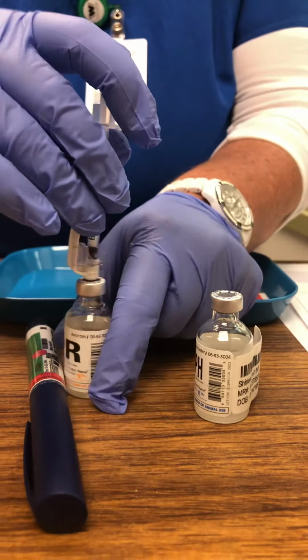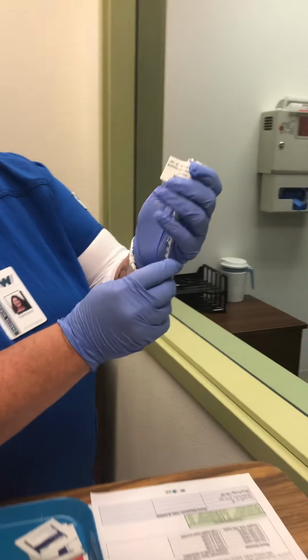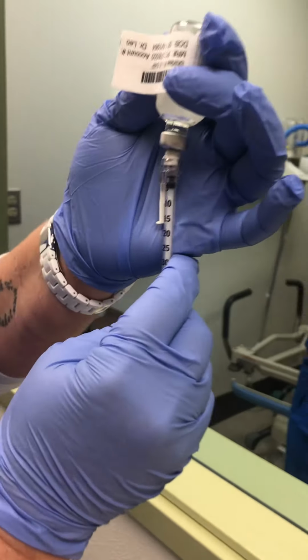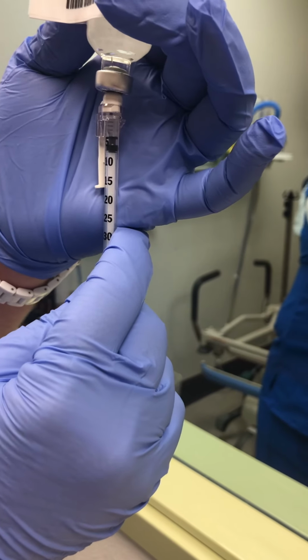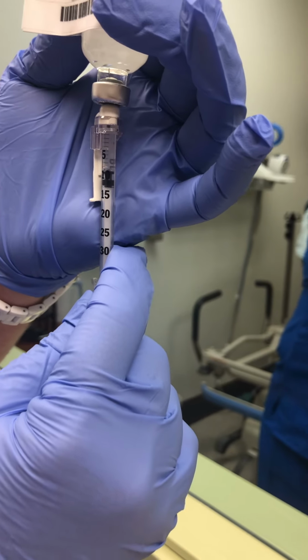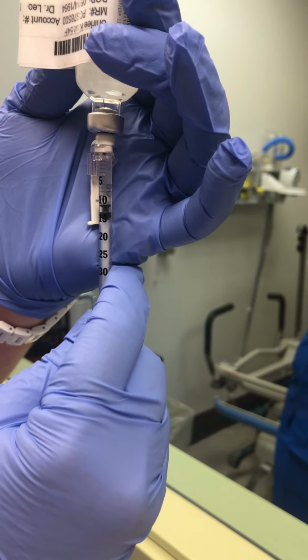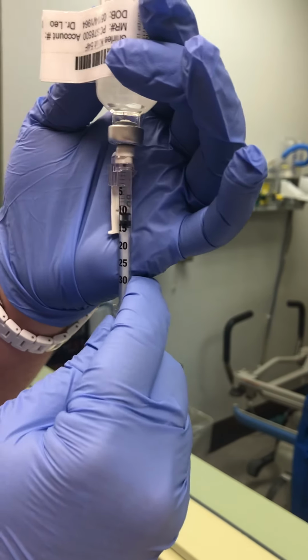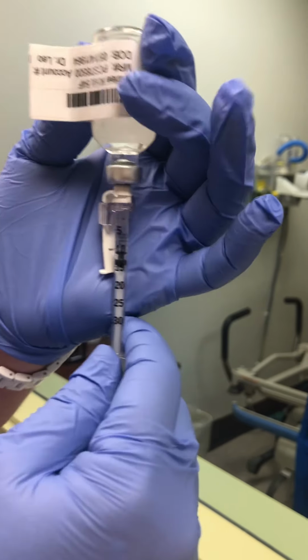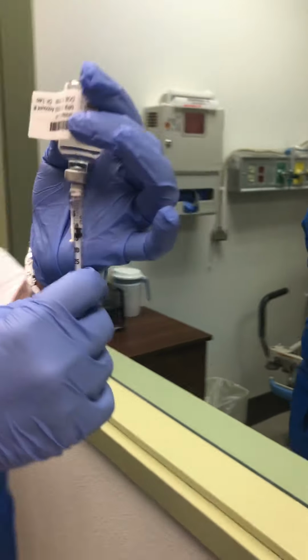And now I am going to pull my 10 units of the regular insulin, being careful, trying not to draw any air bubbles. And then once I do this, I am going to have my nurse double check this. Yep. Verified.